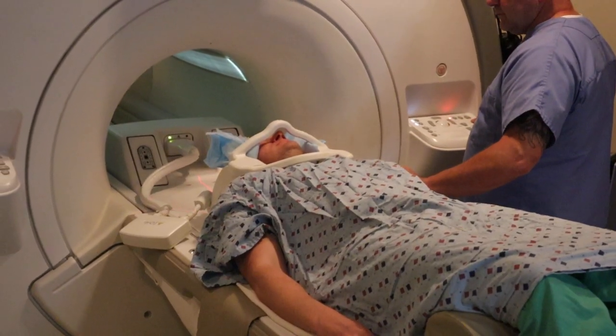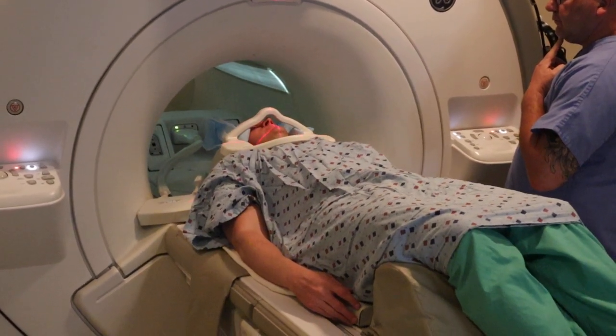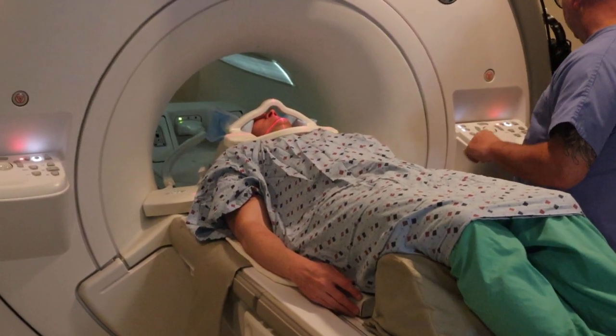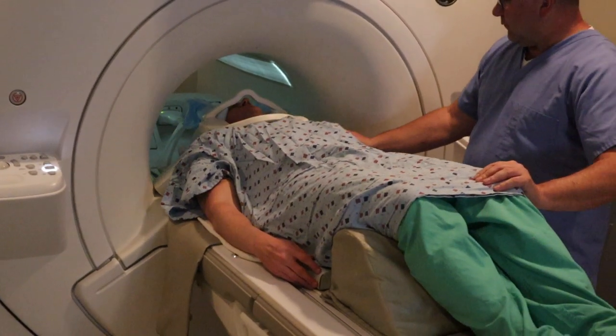The landmark is going to be C4 for the cervical spine study. This also goes for a soft tissue neck. You're going to landmark and advance to scan.